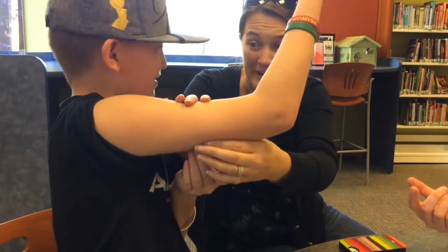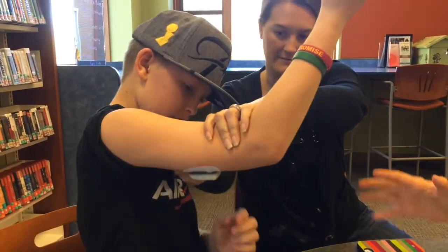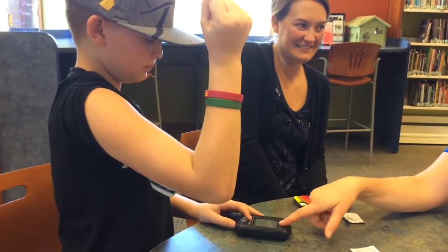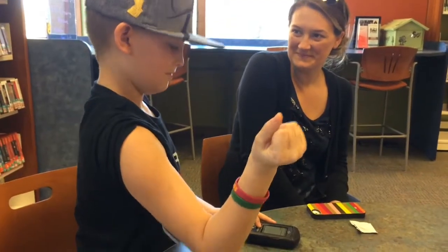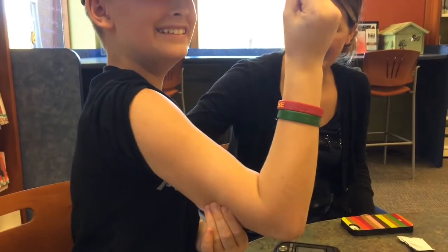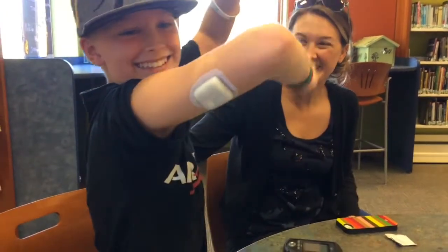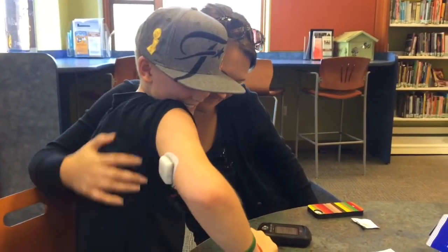I feel fine. It's going to be there for three days. If you go like this with your finger and really seal up the tape — it's okay. You'll get folds the first couple times you try it. Good job. You can hit next. And then once you hit start, Daylon, it makes like a clicky noise — tick, tick — and it goes pop, and it does like a real quick shot feeling, and it goes away, I promise. Ready? One shot every three days. You're done! Yay! I got it. Good job.